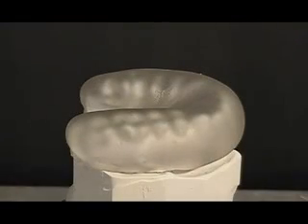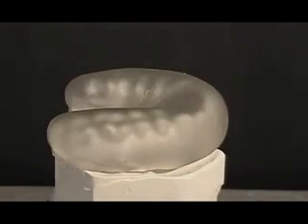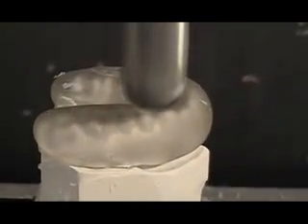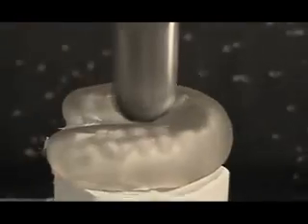The splint model is covered with acrylic and mounted in the milling machine. The acrylic is machined down to the splint surface with the accuracy of standard CAD/CAM systems used for crown and bridge.